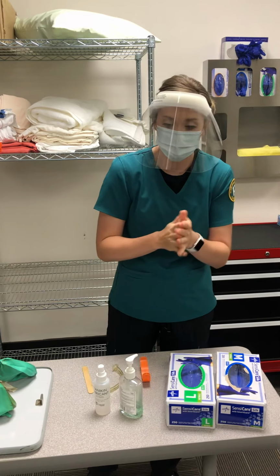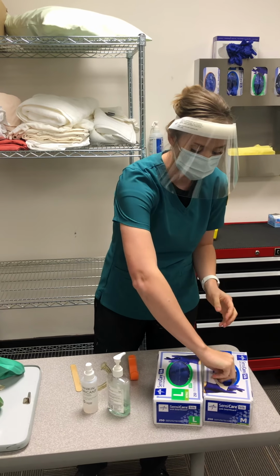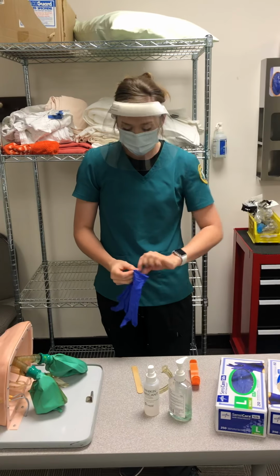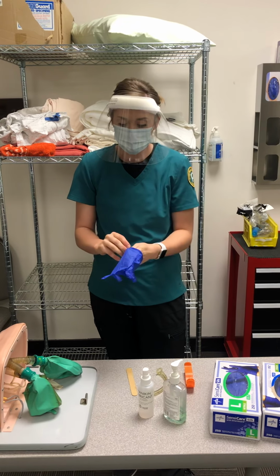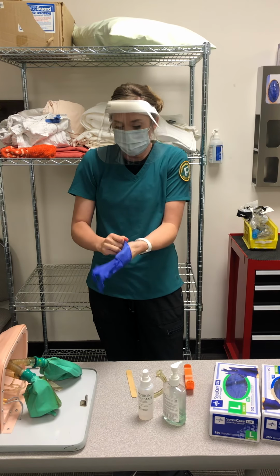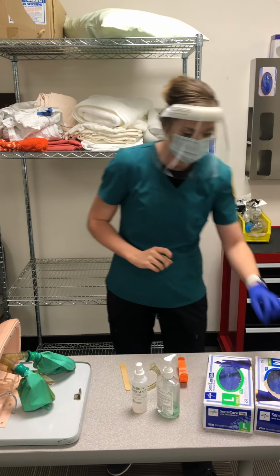The oropharyngeal airway is used on unconscious patients. So the first thing I'm going to do when I get into the room is verify the patient identity by checking their bracelet. I will then assess the patient's vital signs and assess them to make sure that this is the proper airway being used.